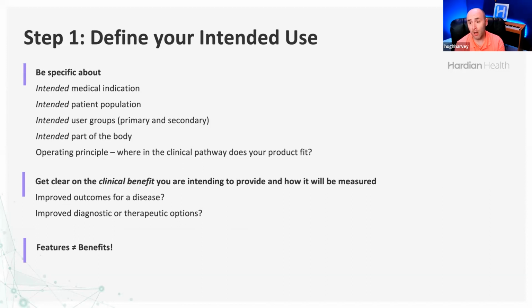If we think about any other medical device that we use, typically in medicine, everything comes with a risk. A thermometer that you can put under the tongue comes with a risk that the thermometer could crack and leak mercury into the mouth. So you have to make sure that you can weigh the benefits against the risks. And the whole point of conducting a clinical evaluation is to prove that your benefits outweigh the risks.